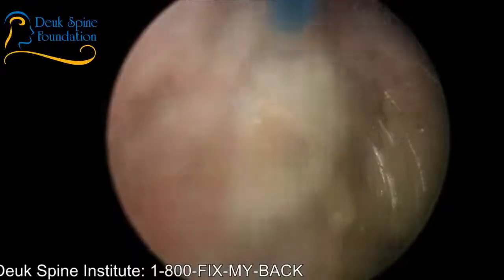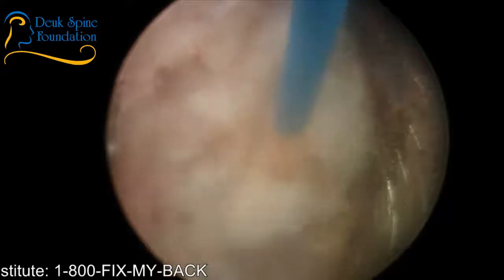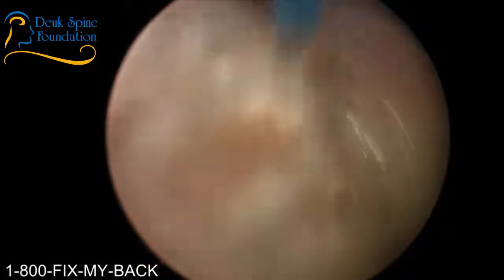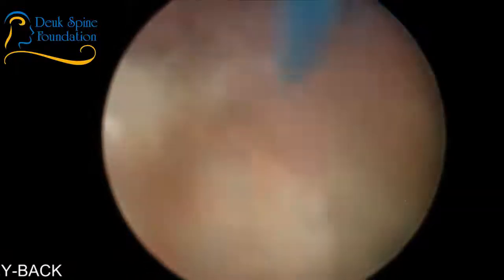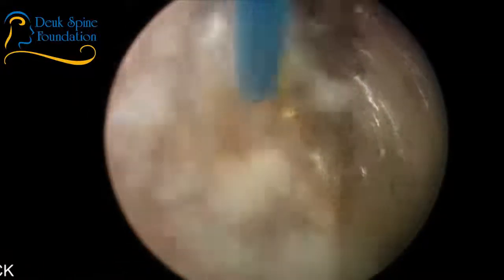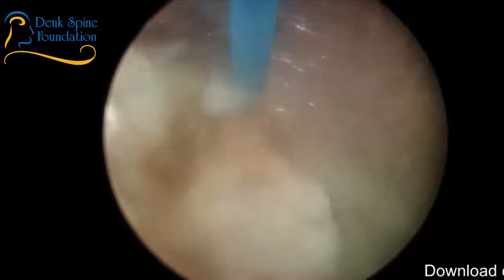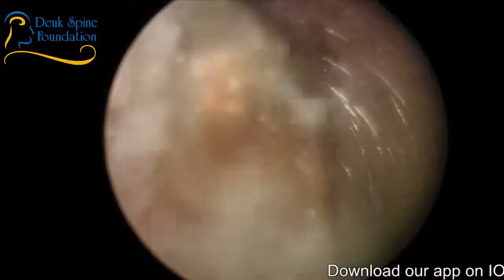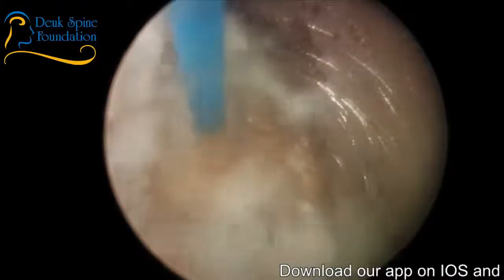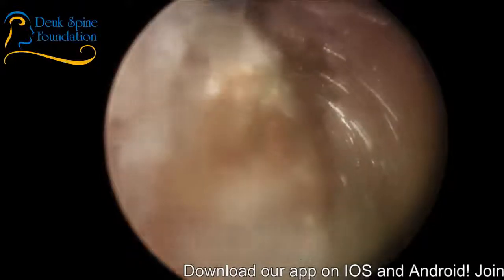So I can't do anything about that. I can't improve your view. I'm sorry, but the reality is I've done this enough so I'm able to know what I need to do even when the view is not so great. It's kind of like a pilot who knows how to fly a jet. Even when they can't see with their eyes that well, they know the landmarks. Or maybe they use a computer or instrument flying.